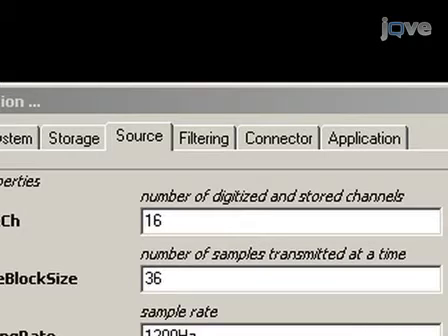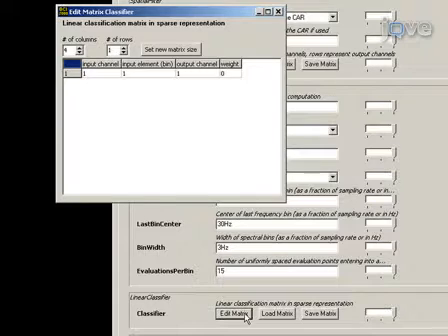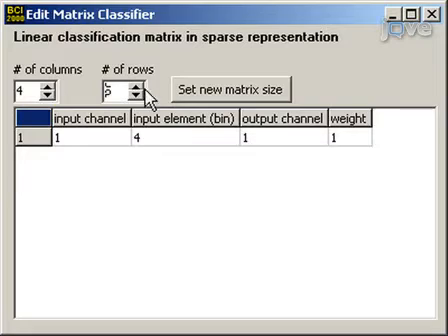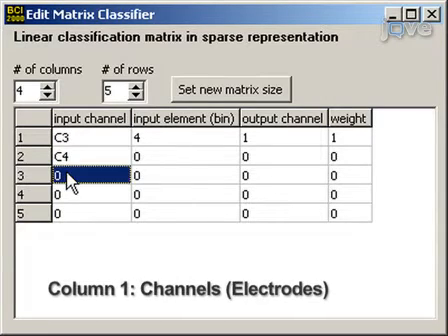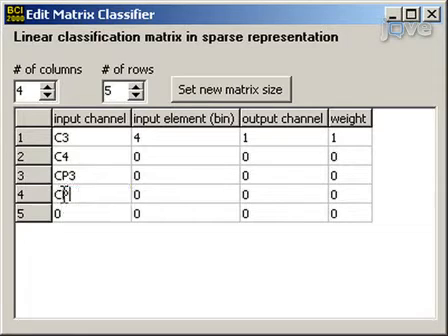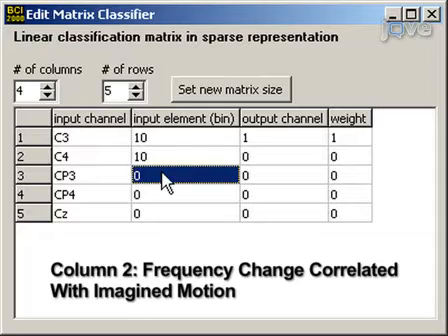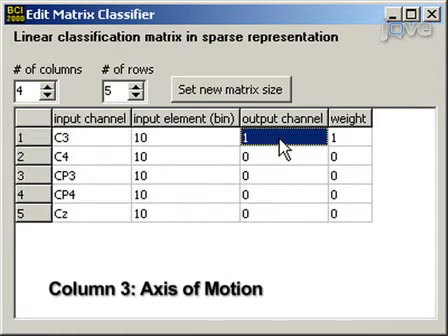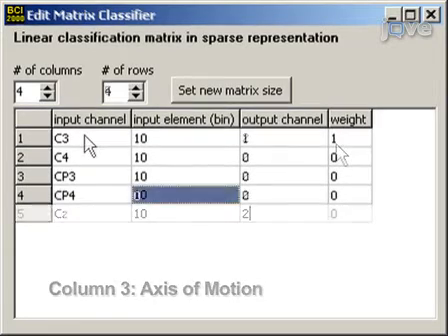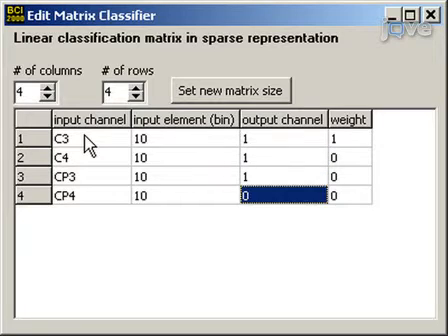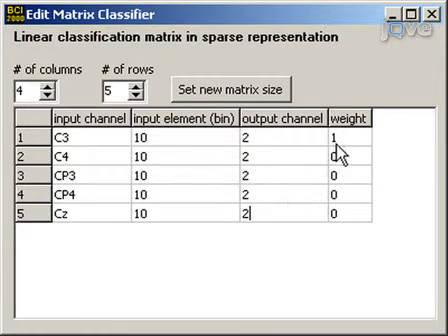Next, configure the classification matrix to use the features you selected. Under the filtering tab, go to the classifier parameter and press edit matrix. Set the number of columns to four and the number of rows to the total number of features selected. Each matrix row corresponds to an individual feature. In the first column, enter all of the channel names. In the second column, enter the frequency bins you have selected to control each motion. In the third column, the output channel, enter the cursor movement controlled by the feature. A value of 1 corresponds to horizontal movement and 2 corresponds to vertical movement. The channels C3, CP3, C4 and CP4 should be set to 1 for a horizontal cursor control task. C3, CP3, C4, CP4 and CZ should be set to 2 for a vertical cursor control task.